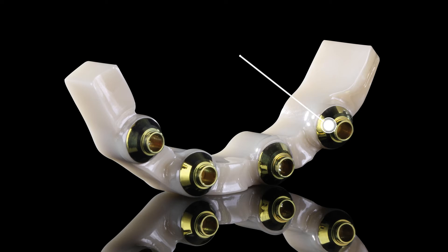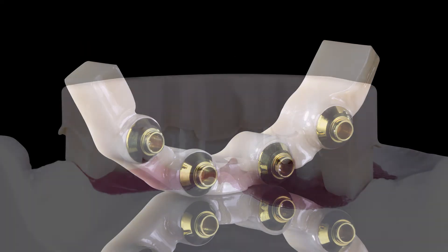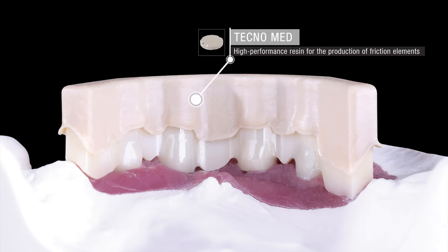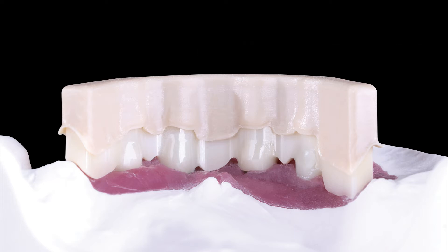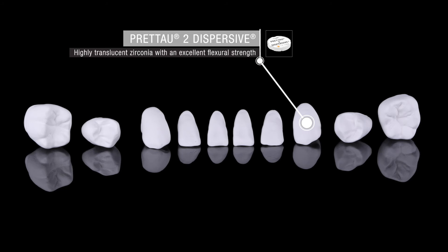The parallel bar was then fixed to the model, digitized, and used as the basis for the production of a friction coping made of Tecno Med resin. After checking function and aesthetics in situ with a resin prototype, the individual monolithic teeth were fully anatomically designed with pre-shaded zirconia Prettau 2 Dispersive.